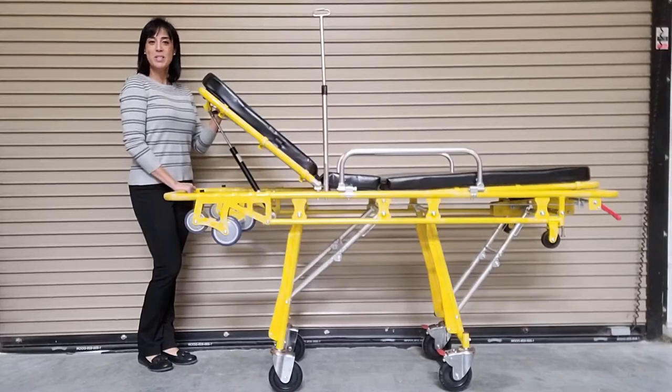Today's video is going to showcase the MS-3C-200C, our heavy-duty ambulance stretcher. This EMS stretcher is designed for both commercial use as well as residential use. This unit can be operated by a single individual.